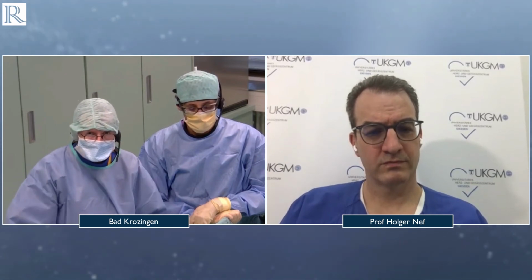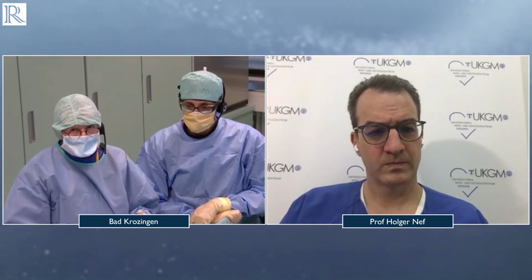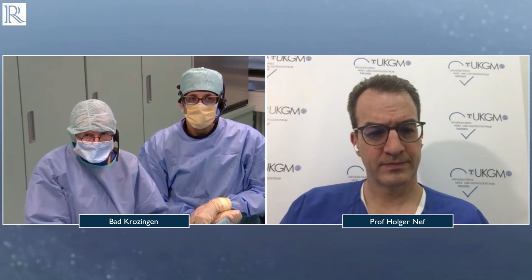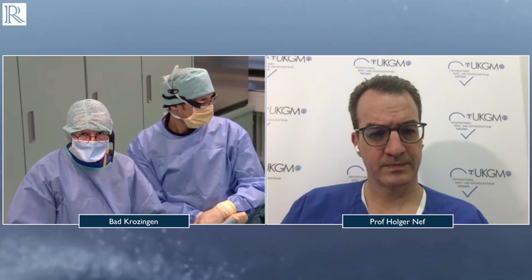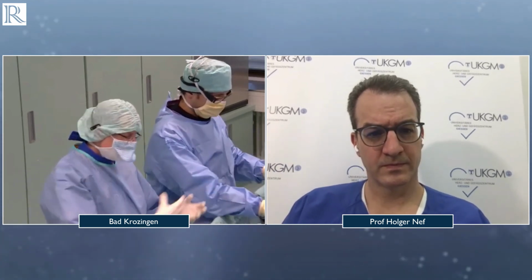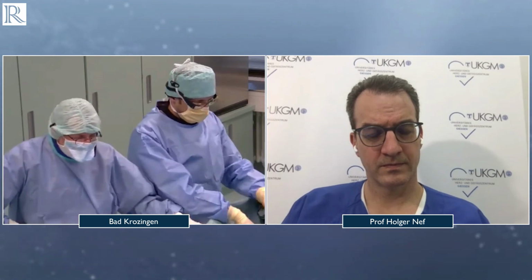It's just one membrane layer. You could damage the balloon, and then you need one more device. So then you have to think about a different lesion preparation setting. Maybe you could go with rotablation, 1.75 burr or 2.0 burr, and then on top of that with IVL.